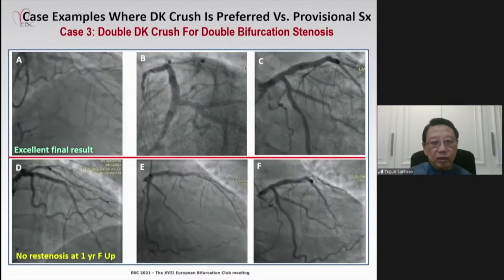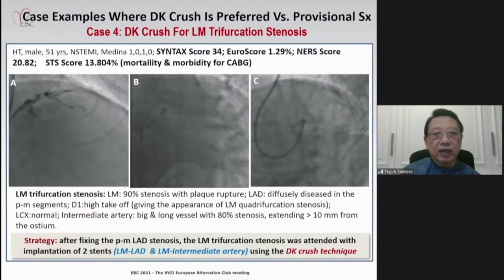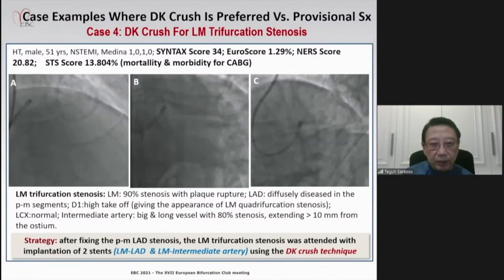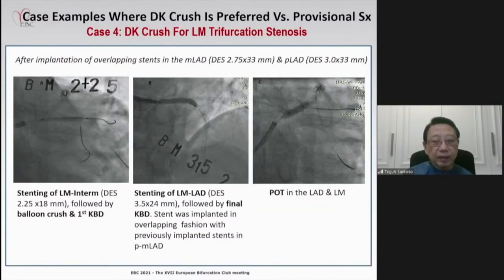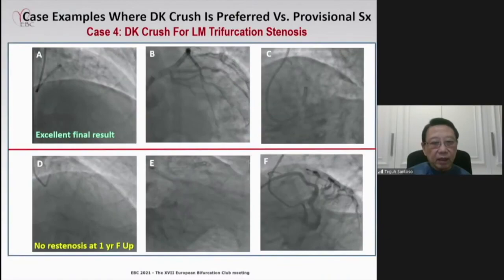Another case: double bifurcation stenosis involving LCx and obtuse marginal, plus left main bifurcation. Fixed with double DK Crush technique — stents implanted in left main to obtuse marginal, two stents in left main to LAD, and LCx — good results at one-year follow-up with no restenosis. A further case with an intermediate branch bifurcation used DK Crush to fix the lesions, with stents from left main to intermediate branch and left main to LAD — excellent final result and no restenosis at one year.